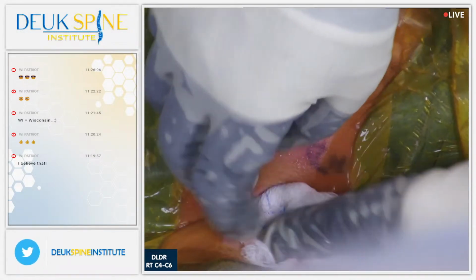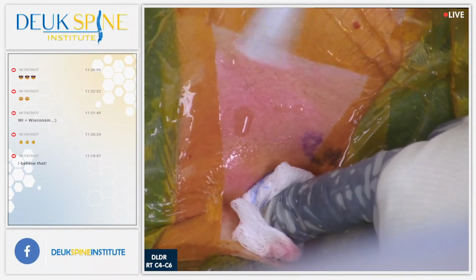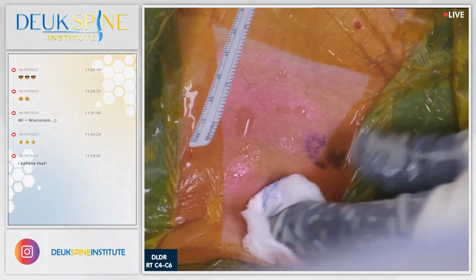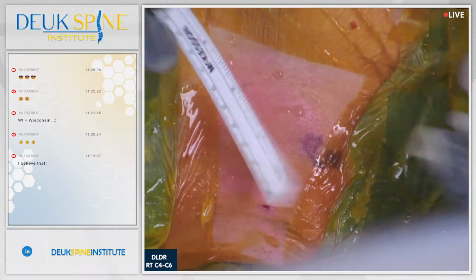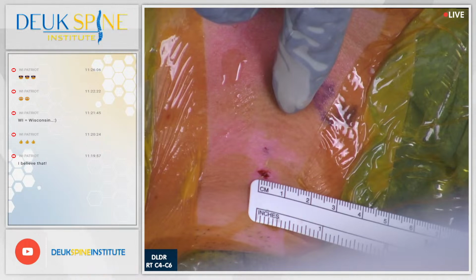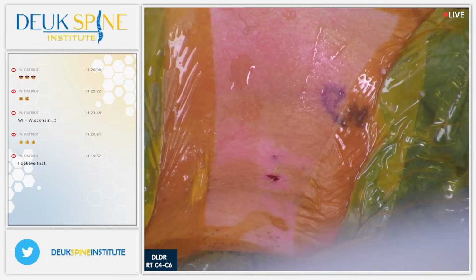You're going to see, folks, this is a 4 millimeter incision. We did 2 discs, 4 millimeters, took us an hour. This patient's going to go home in 1 hour. There's no hospitalization. There's no fusion. Any other surgeon would have done a fusion on this patient, ACDF or artificial disc. And there it is. You guys see this? Yes, we do. Perfection. 4 millimeters. The whole surgery, 4 millimeters. Great job, team. Thank you so much.